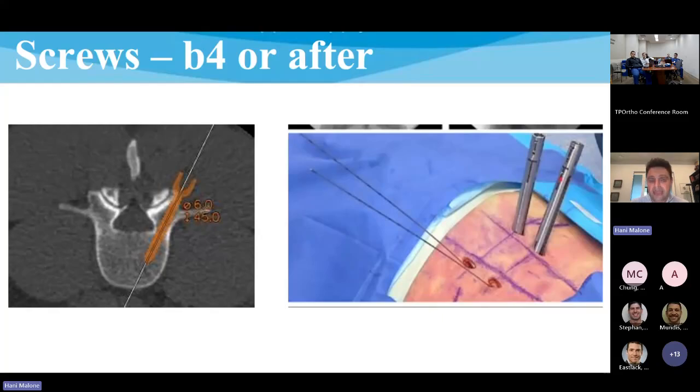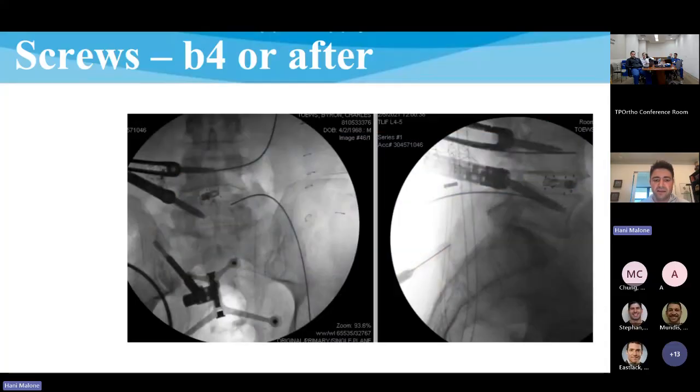So I'll at least cannulate the pedicles prior to the interbody work, but I'll just put in K wires on the side of the TLIF and then bend them out of the way so that they're not interfering. And that's sort of what you're seeing here. The contralateral screws are in, the ipsilateral ones just have K-wire localization.